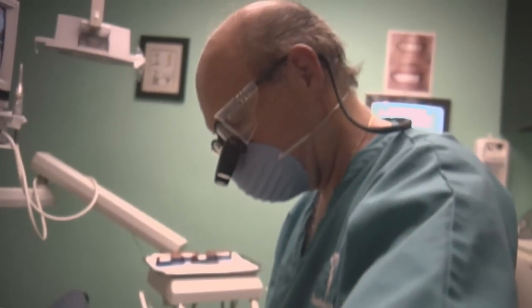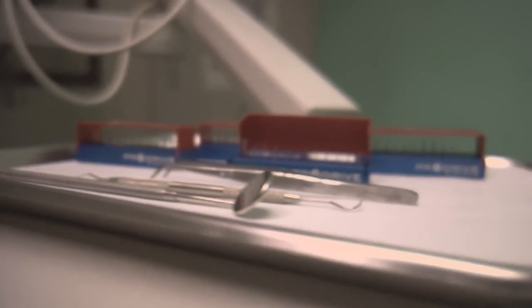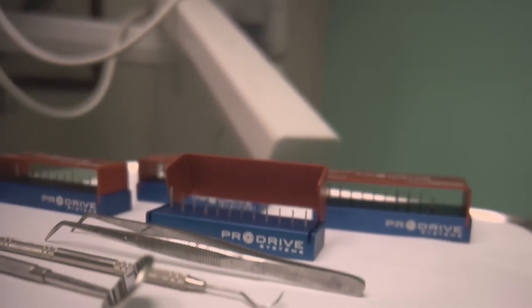Patient comfort. Why is it increased patient comfort? One, the procedure's quicker. Two, because there's less whipping of the burr, you're getting less heat generated and a much more accurate cut. It's really important, I think, from the patient's standpoint to shorten the amount of time that they actually have to have a handpiece put on the tooth.